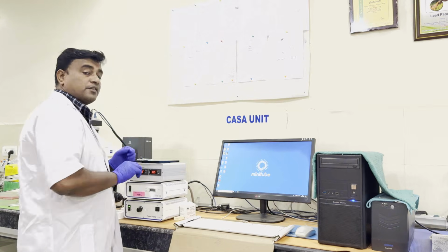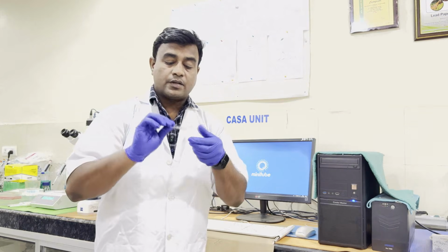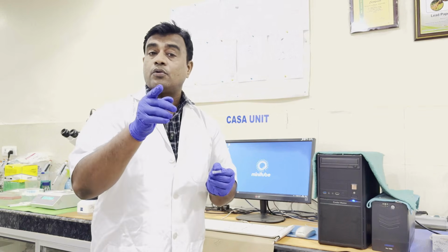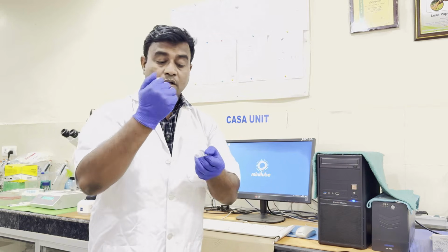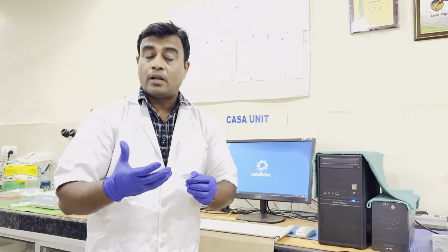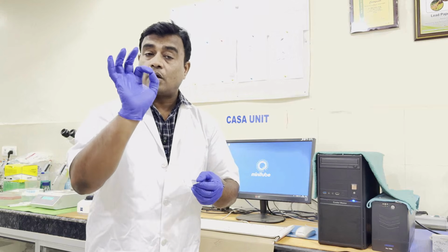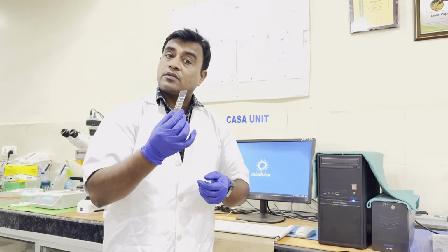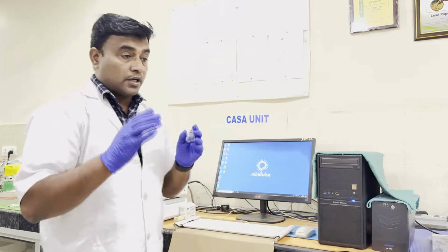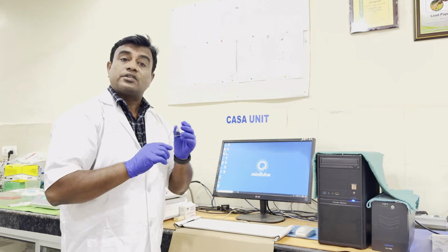Besides this, there are some precise slides. Minitube has its own slides, known as chamber slides. These are the 4 chambers where the loading is done from the upside. I will do the same loading process in part 3 of my lecture, where I will show how to successfully load the semen samples for an equal, uniform distribution inside the chamber without spaces or bubbles. Around 3 microliters of semen is loaded in every chamber, but these are expensive slides. So when we are doing research or any higher-end work, then we use these slides.